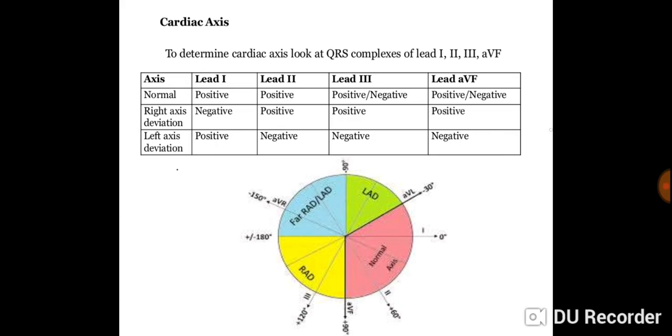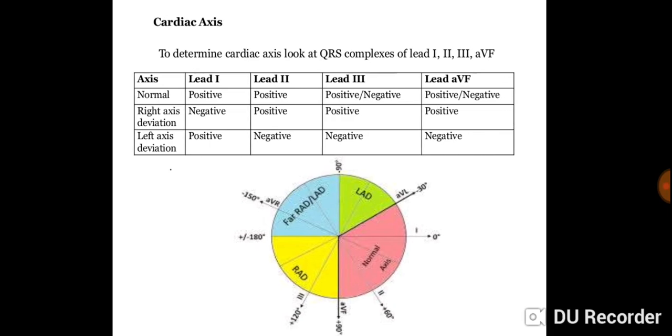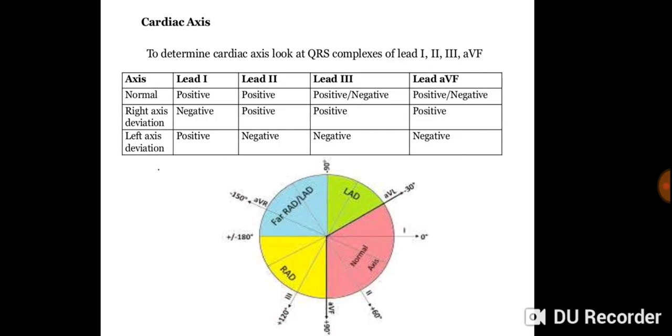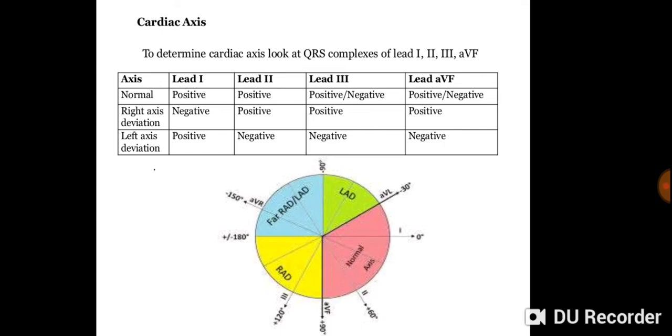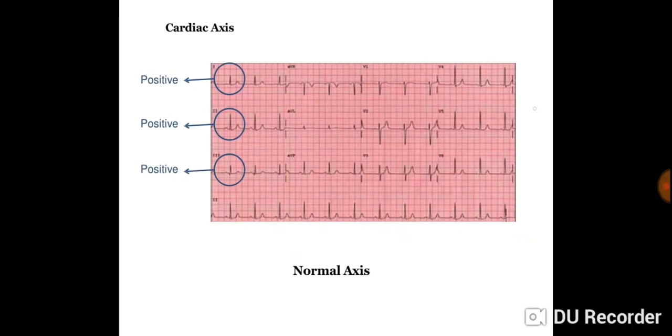So more on this, I hope, in some other video to find the axis of the heart. I'll explain it by demonstrating it myself. You can check it out. It's really easy to learn and really important.